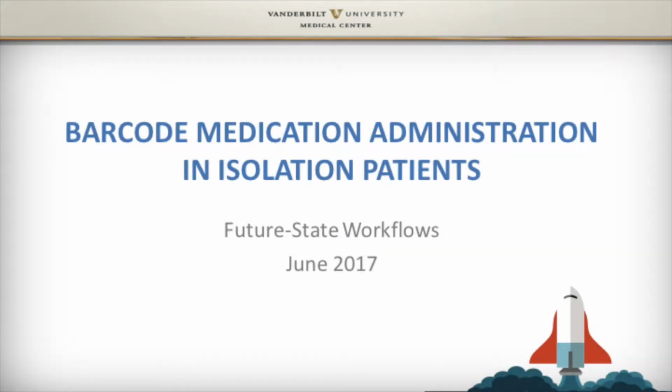With the implementation of eStar, there will be a few changes to the medication administration workflow. These changes will especially affect medication administration for isolation patients. This module has been created to go over these changes and demonstrate the new workflow.